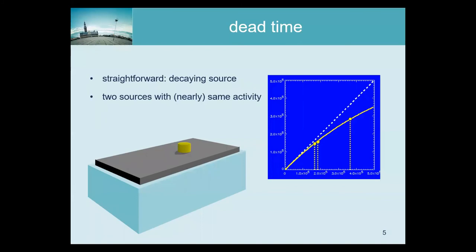All right, I skipped this one, which is pretty straightforward. So if you want to measure the dead time, again, something you typically don't do every day, because it would be hard for a scanner to have it changed unless something was really wrong. But you want to know the dead time of a new scanner, and you want to check it every year.